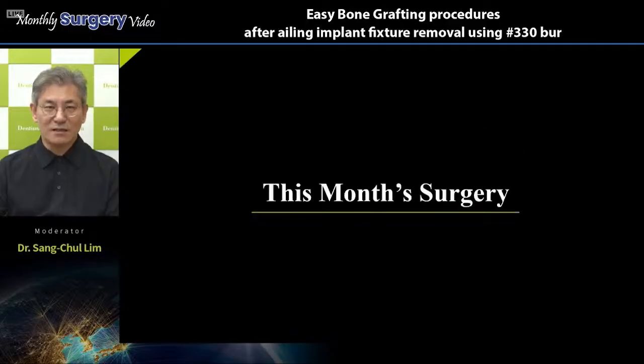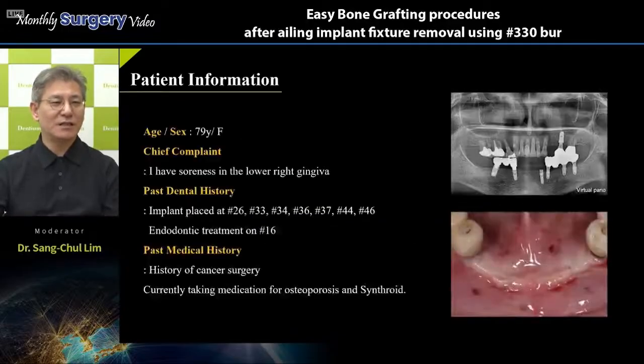Surgery procedures lesson. Okay, let's move to today's surgery. Patient information: our patient today is a 79-year-old female. Her chief complaint was, "I have soreness in the lower right gingiva."